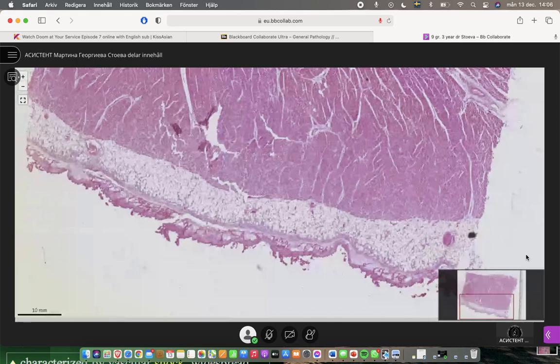So here, I would say that this is more an example of diffuse fibrinous pericarditis than a localized form, like it is when it's over an area of myocardial infarction. If you already had to look at the videos with the jars with gross specimen, this is one of the examination jars with gross specimen, the fibrinous pericarditis.